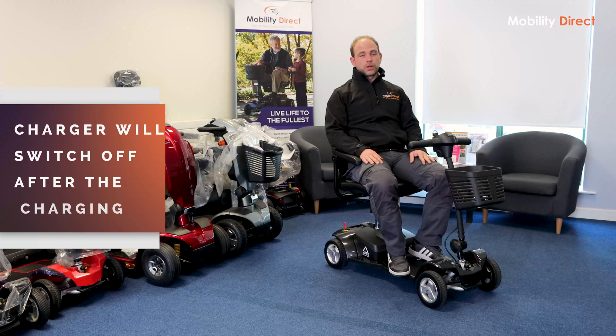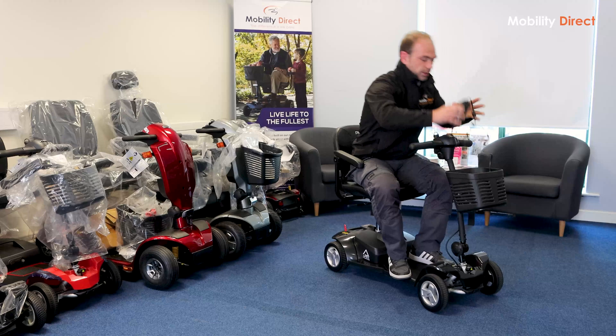It's perfectly safe to leave the charger plugged in. Once the charger has finished its charging process, the charger will switch off. There's no issue with leaving it plugged in overnight.